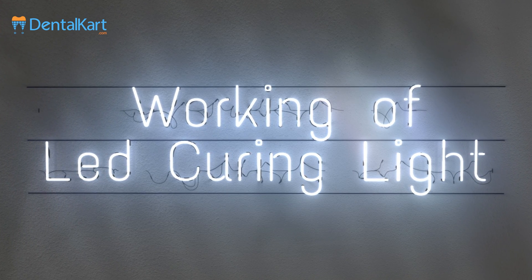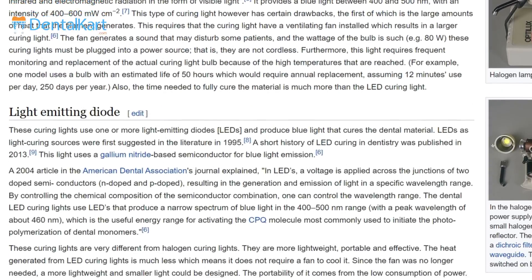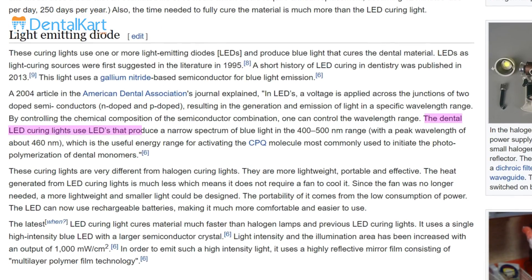Walden Smart LED Curing Light comes with an ultra mini design used for photopolymerization of resin-based composite and different dental materials that are to be cured using LED lights. The dental LED curing lights use light emitting diodes that produce a narrow spectrum of blue light in the 400 to 500 nanometer range, with a peak wavelength of about 460 nanometers, which is the useful energy range for activating the camphor quinone molecule most commonly used to initiate the photopolymerization of dental monomers.